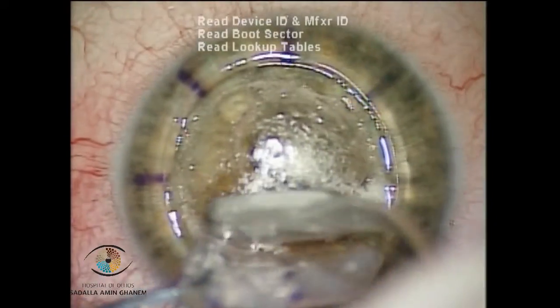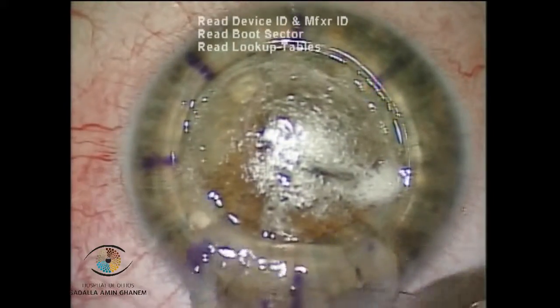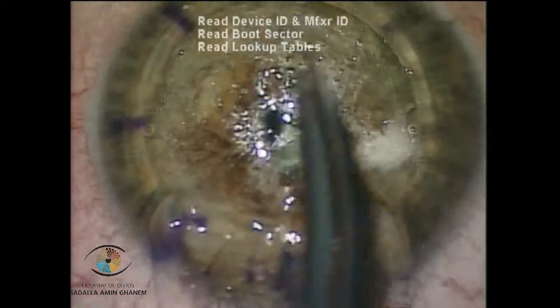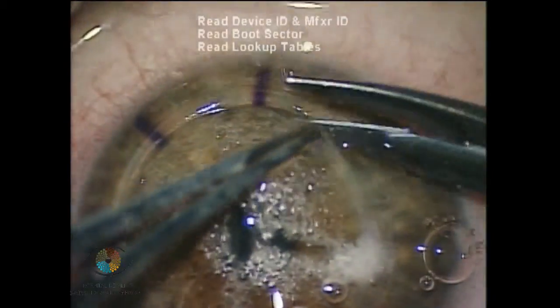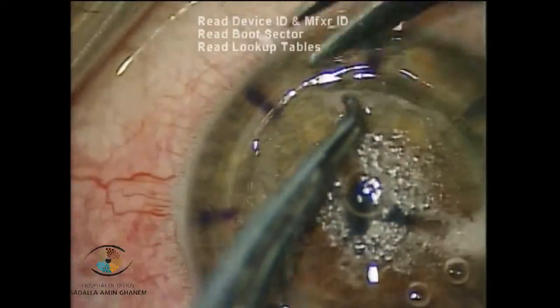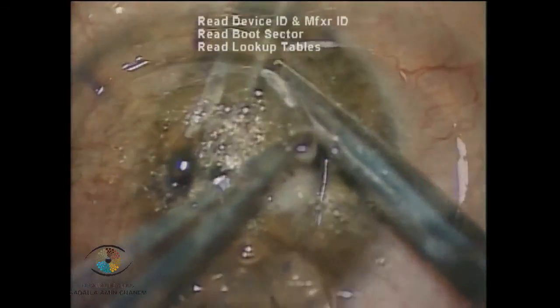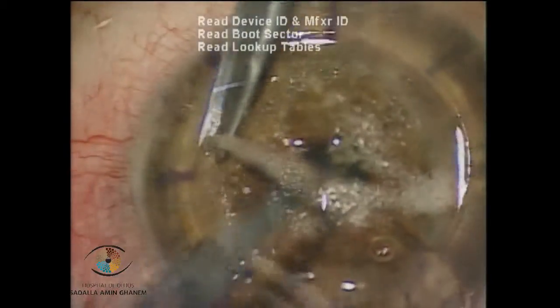This may allow the exposure of the Descemet's layer or the pre-Descemet layer. The final step is to remove the posterior stroma. In this case I prefer to remove the stroma in the central area completely and only partially in the peripheral area.